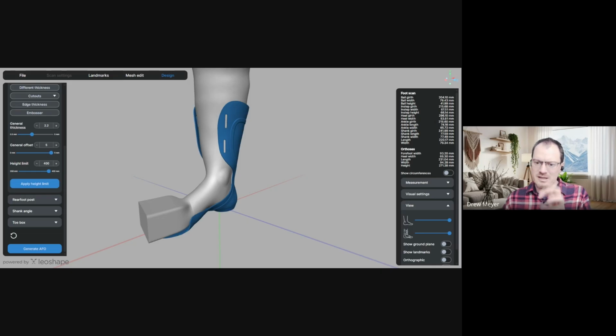So I don't know if that's exactly what you're getting at, but it is a hotly requested item to be able to have a comparison between your original and whatever modifications that you've made. So that is something.